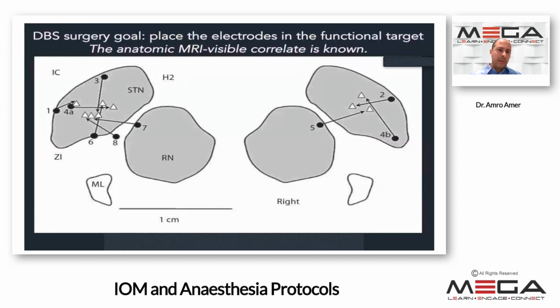That's another way, DBS. We usually do that for brain movement disorders. For example, we want to look for the subthalamic nucleus, and once we locate it using a microelectrode, then the surgeon can look at it. And if we stimulate it in a specific parameter, the patient hopefully will stop his symptom.